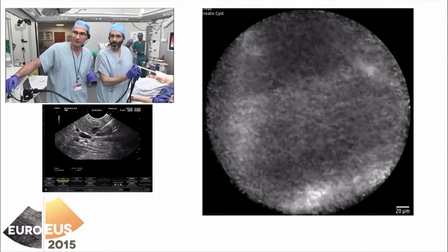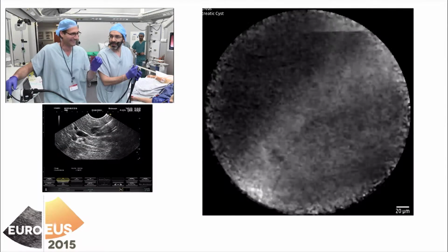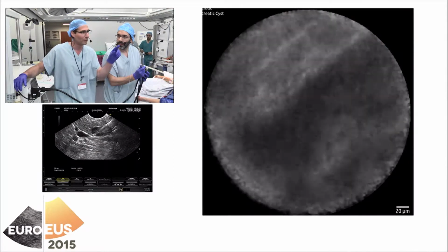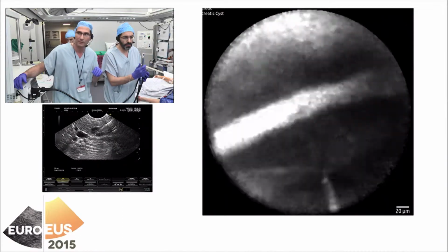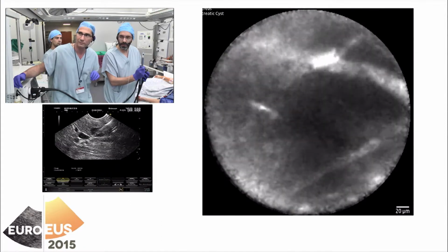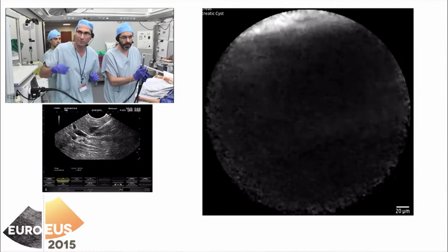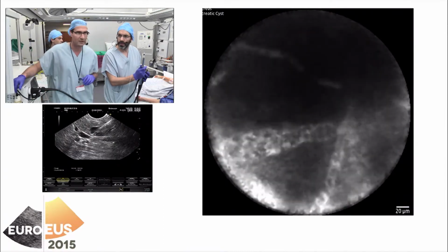Okay, here you need to learn to be a pathologist more than an endosonographer also. It's another type of black and white imaging. Yes, in white it's vessels, so you have to move just a bit against the wall. So I just press, okay. Very nice. Okay. Perfect. We are waiting for fluorescein.